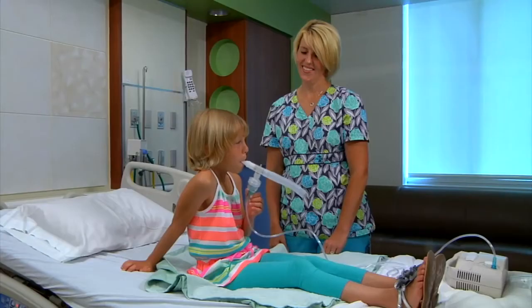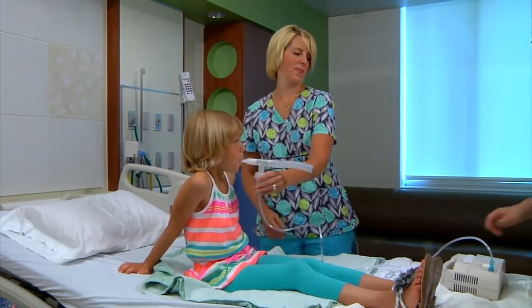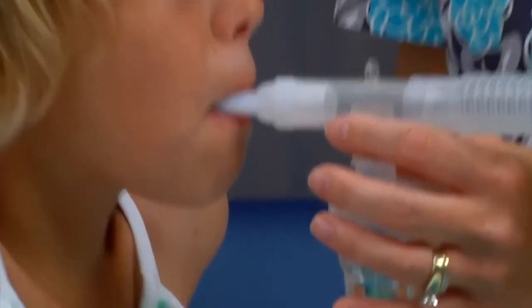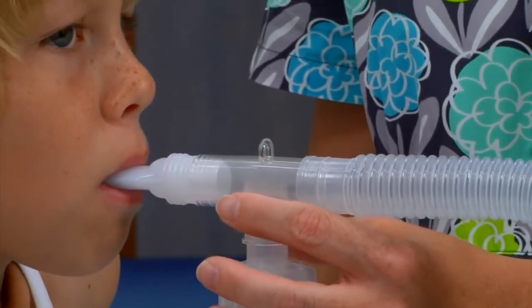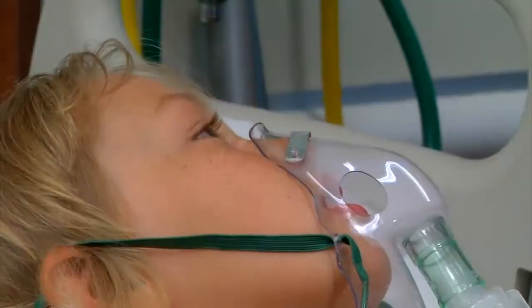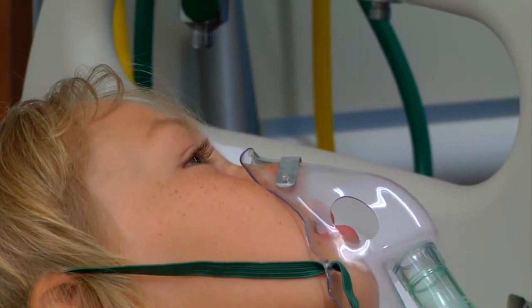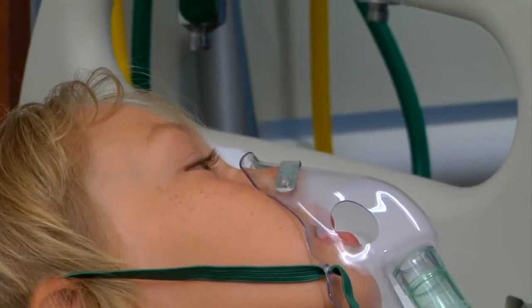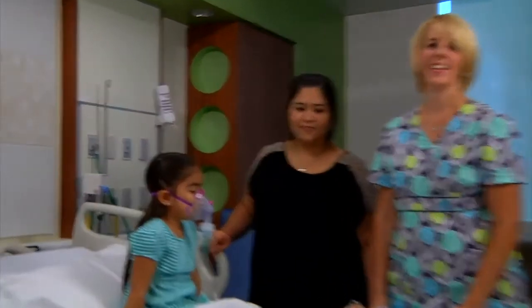And then we move on to nebulization. A face mask or mouthpiece may be used for nebulization. The medication is vaporized to be breathed in by the patient, wherein it works similar to an inhaler, although a mask may be used for children under the age of 7, and a nebulizer is used only if the doctor recommends it. So it's an aerosol, and when the medicine is breathed in as an aerosol, it is easily deposited deep into the lungs.